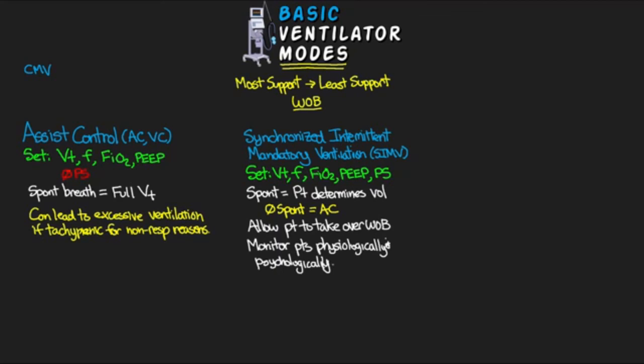All right, so the last mode that I want to talk about here is something that we call pressure support. Now, oftentimes you'll hear this referred to as CPAP. Let me tell you, this is not CPAP. Please don't call it that. And in talking about pressure support, this actually technically isn't a volume control mode of ventilation. Because in volume control, we are setting and controlling the volume that our patient is getting, and pressure support is a form of spontaneous breathing.